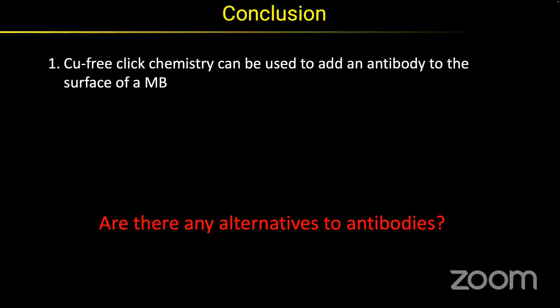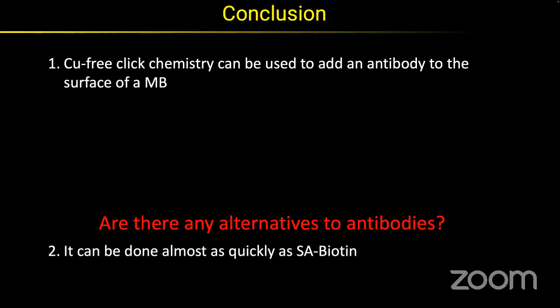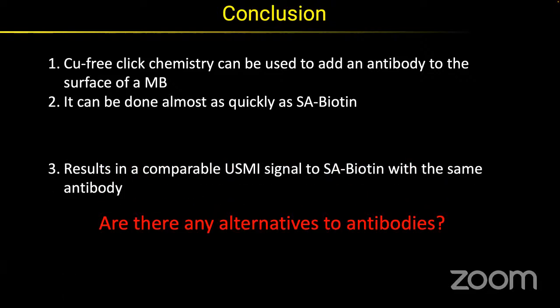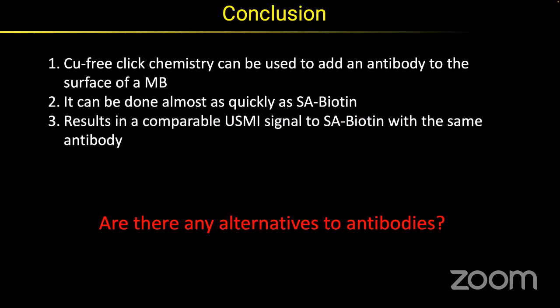So to conclude, we were able to use copper-free click chemistry to add an antibody to the surface of a microbubble. This can be done almost as quickly as streptavidin biotin, and the results are comparable in ultrasound molecular imaging to streptavidin biotin with the same antibody. We were really happy about this because if we can start switching people from the biotin streptavidin approach to this DBCO azide approach, we can get them to skip this first step in clinical translation.